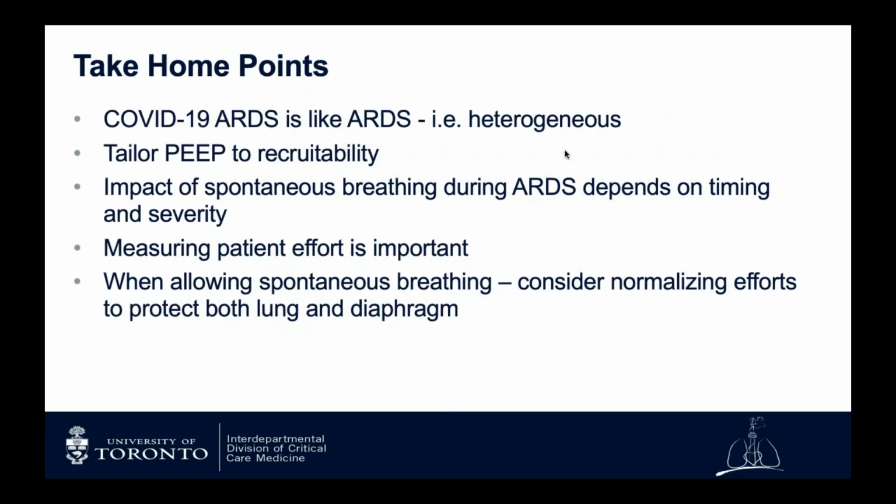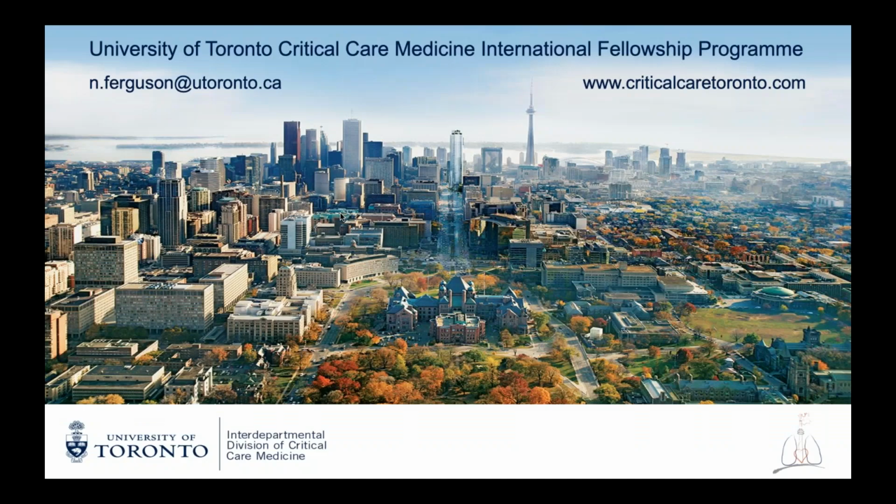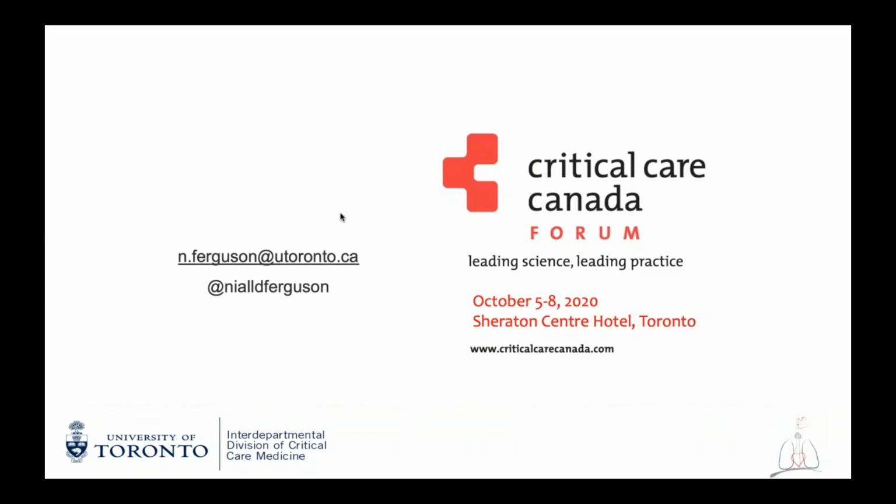So I've tried to show you that the COVID-19 ARDS is like ARDS, it's heterogeneous. We should try to tailor PEEP according to recruitability. The impact of spontaneous breathing depends on ARDS timing and severity. Measuring patient effort we think is important. And when you're allowing spontaneous breathing, you may consider normalizing efforts, but keeping in mind that we're wanting to protect both the lung and the diaphragm. And with that, I will stop and thank you for your attention and be happy to take questions.